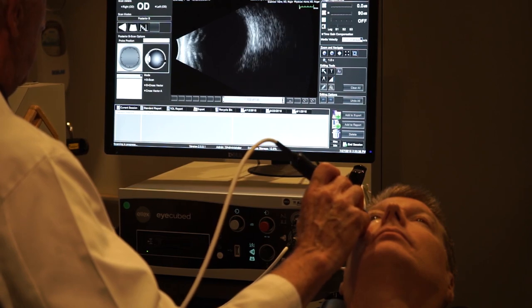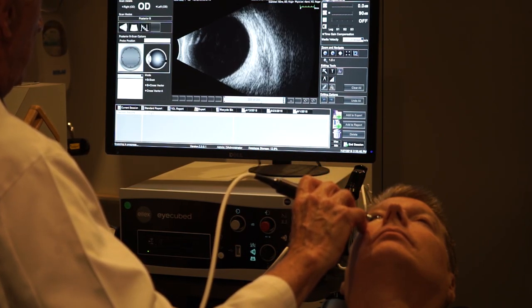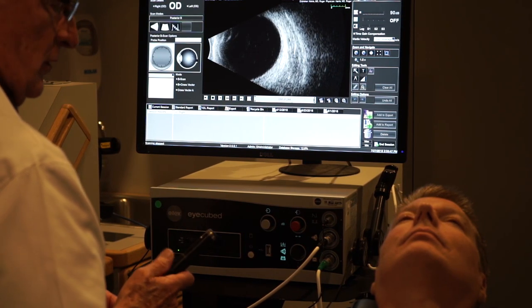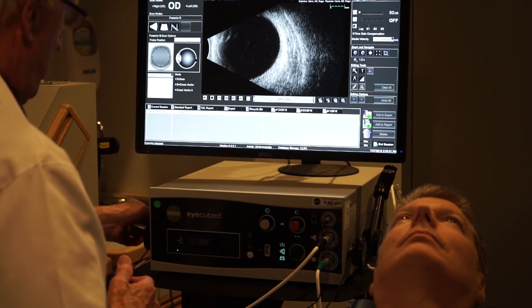Looking here again, we have some vitreous opacities — I would call this vitreous syneresis. I don't really see a posterior vitreous detachment, just little dots in the vitreous which are very typical for most people. That's the B-scan technique.